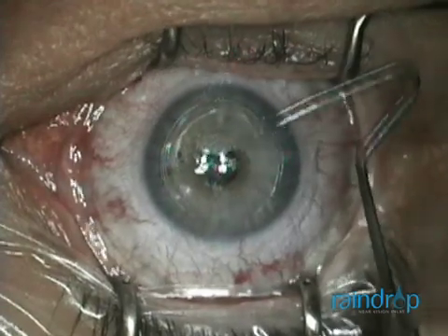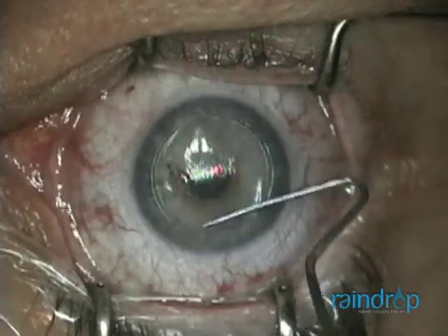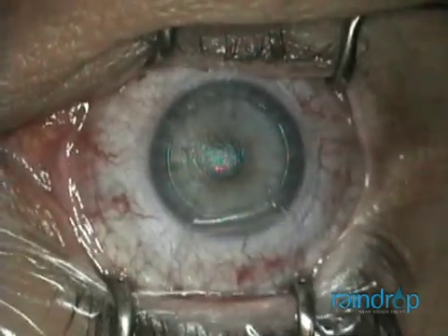Once I lift the flap, I will place the Raindrop Inlay on the dry stromal bed and easily center it over the constricted pupil.